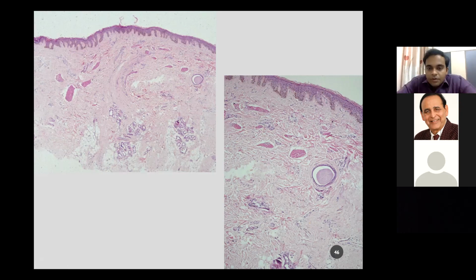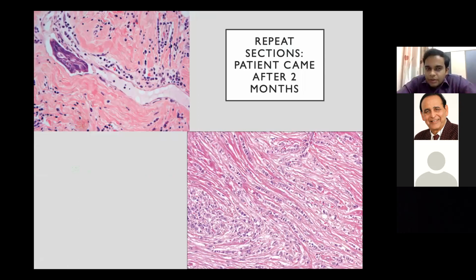But this was something which was not very specific for us in dermatology. So what you can see here in the upper photograph, you have some dark staining nuclei. Okay, big size dark staining nuclei which are infiltrating between the collagen bundles and in a perivascular location. And if you see the lower image, then they have this pattern. They are present in strands, linearly in between collagen bundles. So this is what is known as the Indian filing pattern. Okay.